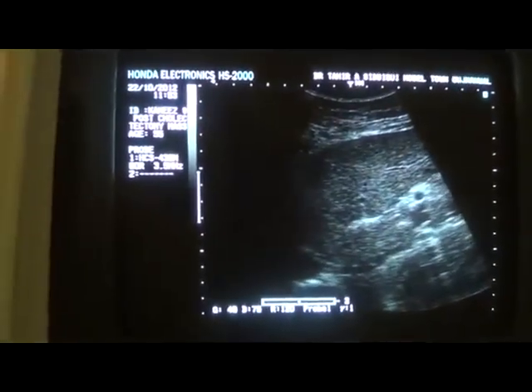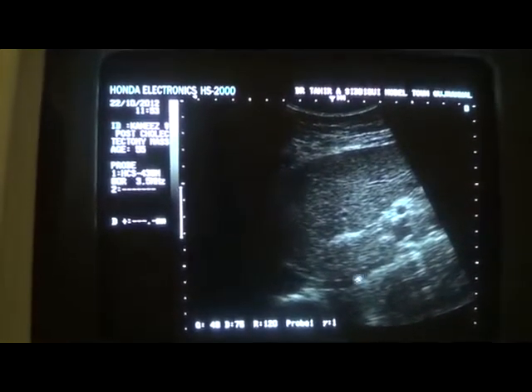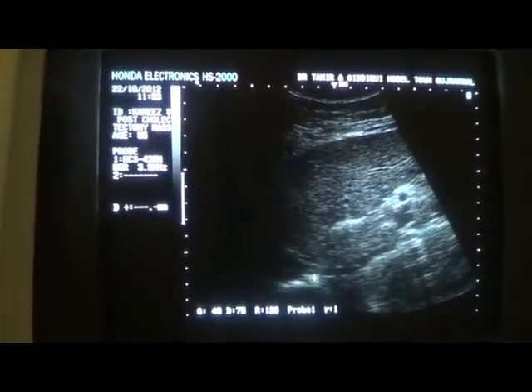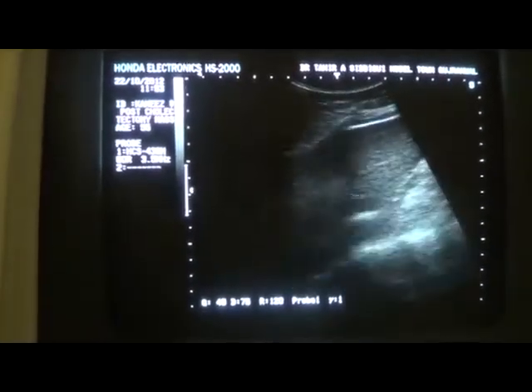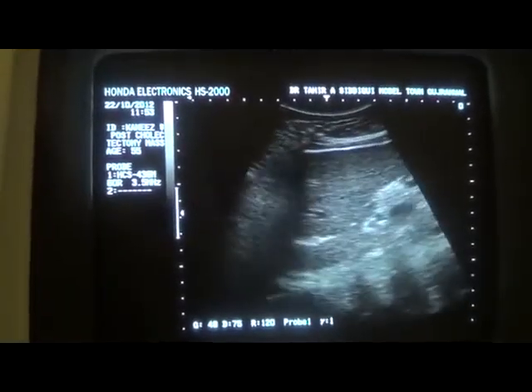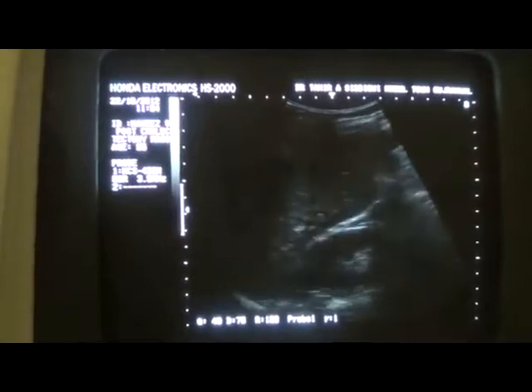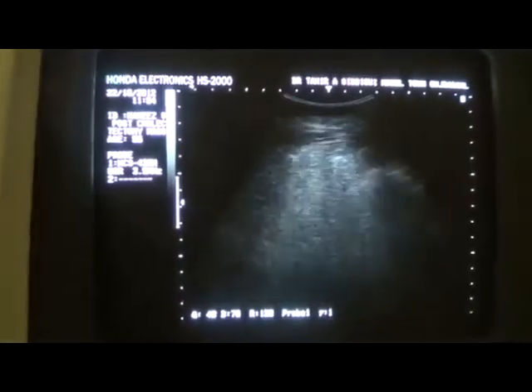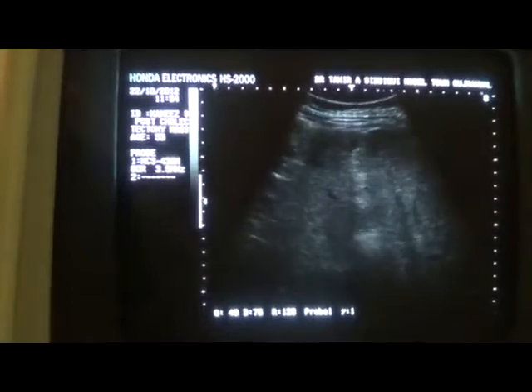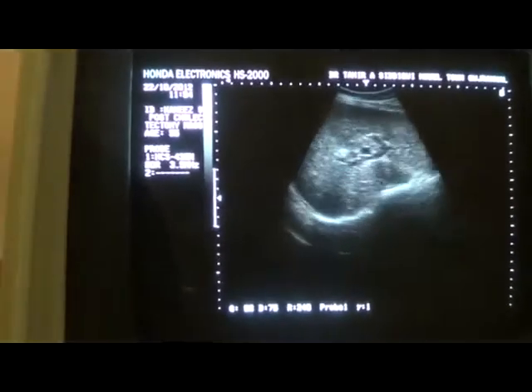Now, this is the left lobe of the liver, the ligamentum venosum, the IVC, and the caudate lobe of the liver. So, the masses that we see do not relate to the pancreas, or to the kidney, as we saw, and not to the liver as well. This is the total view of the liver.